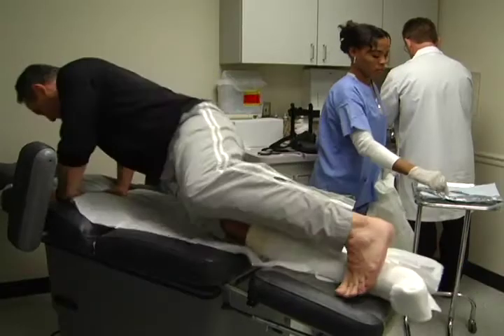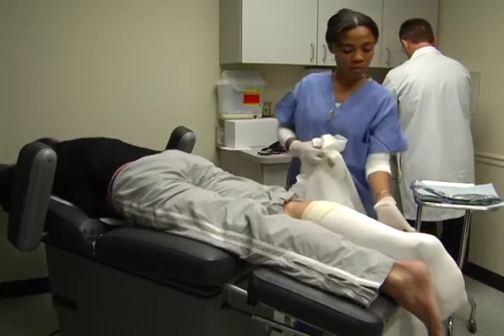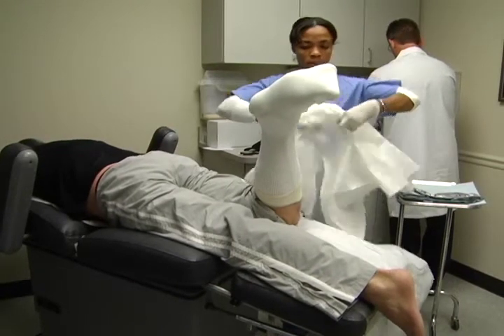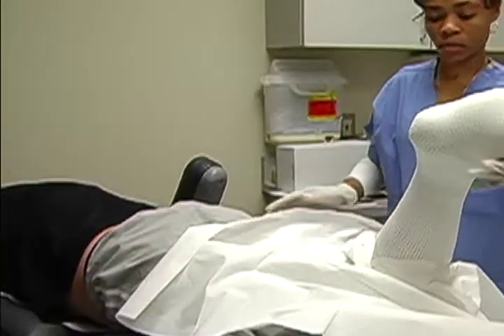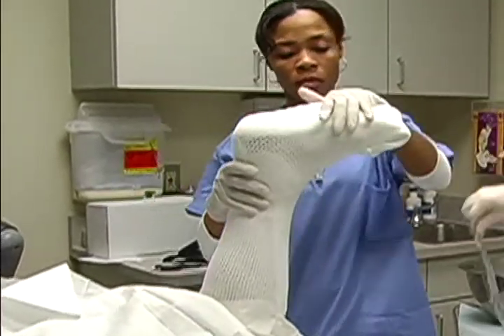Step 6. Patient positioning. Place the patient on their stomach in the prone position. Although it is not optimal, the TCC EZ cast can be applied in a seated position if the patient cannot roll over. To protect the patient's clothing, you may drape the patient. Flex the knee and ankle to 90 degrees and position the foot in a neutral alignment.